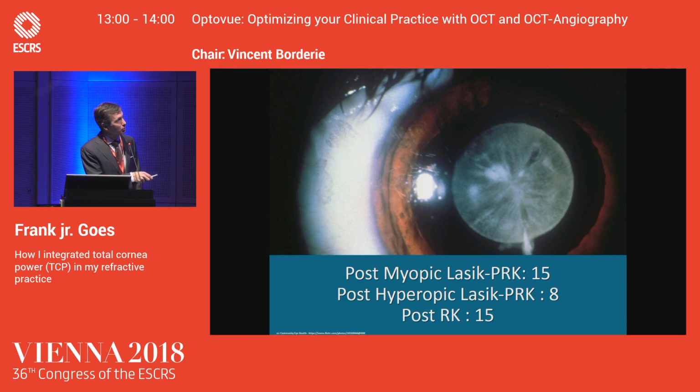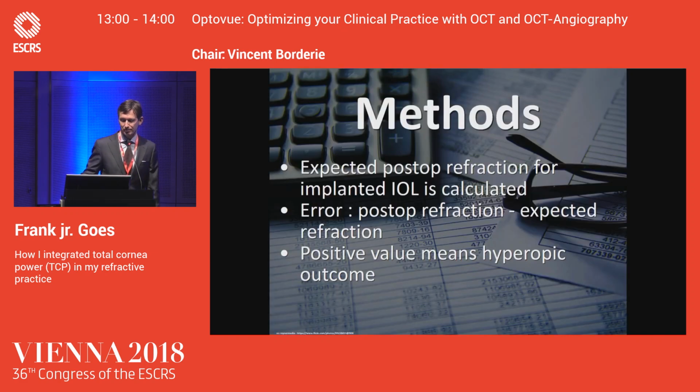So we had a group of 15 patients that had a previous myopic LASIK or PRK that underwent cataract surgery afterwards. We had a group of 8 patients that underwent previous hyperopic LASIK or PRK and that had an IOL afterwards, and 15 patients had RK with an implant afterwards.